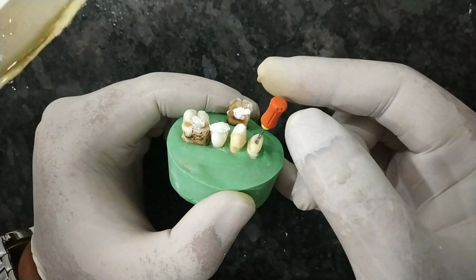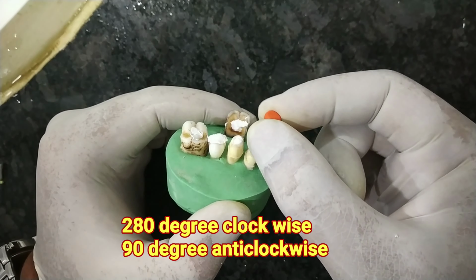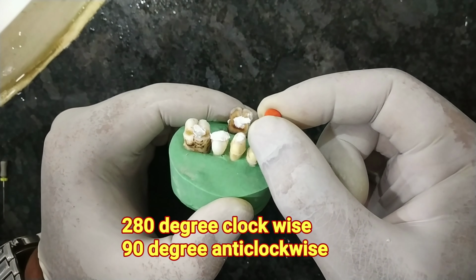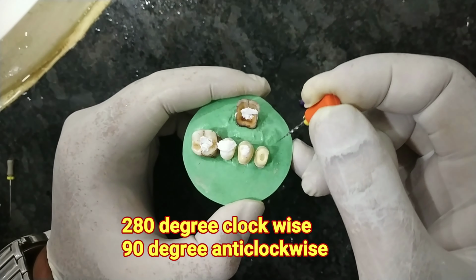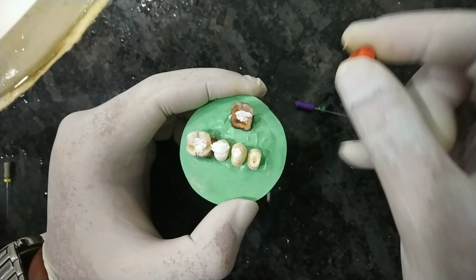So start with the SX file, just this much rotation, then reverse 90-degree rotation, 3/4 and 90, pull it. Similarly palatally, 3/4 and 90, pull it.